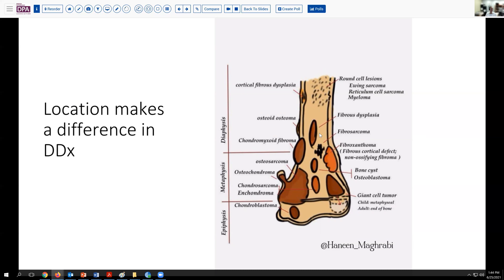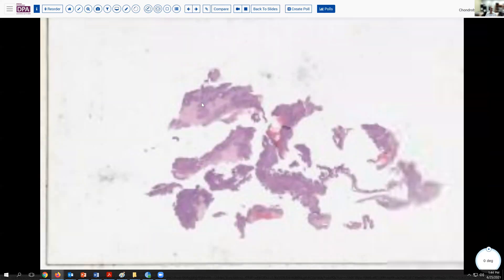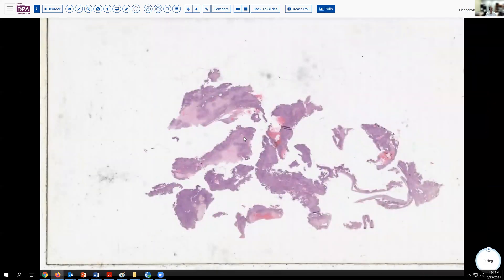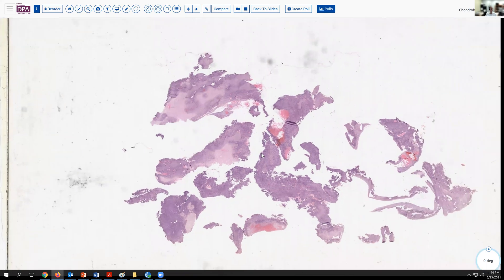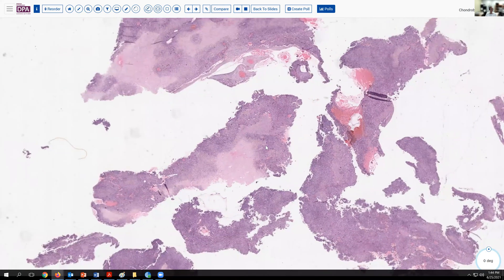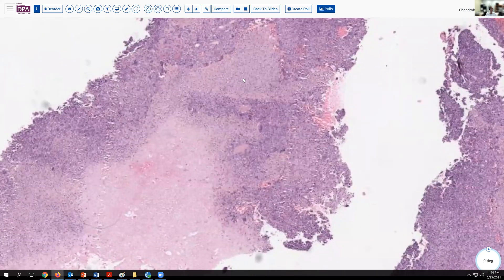Other processes can involve the epiphysis and are important considerations as well — it's not just tumors we're concerned about. Bone cysts can be in both locations. Infection certainly can be in both locations, and those enter into the consideration as well. So let's jump and take a look at what the slides look like for this patient. Here we see some nice curettage material with some variable pink and blue areas that jump out at us.